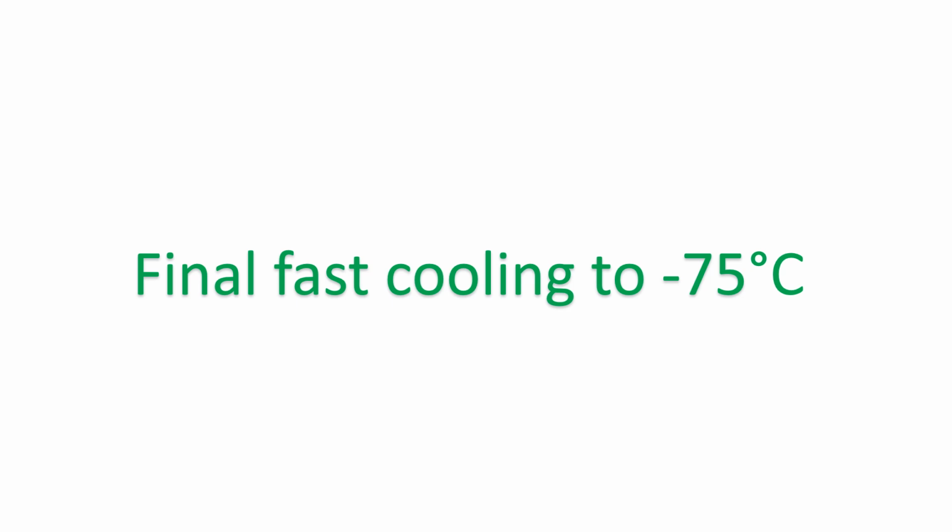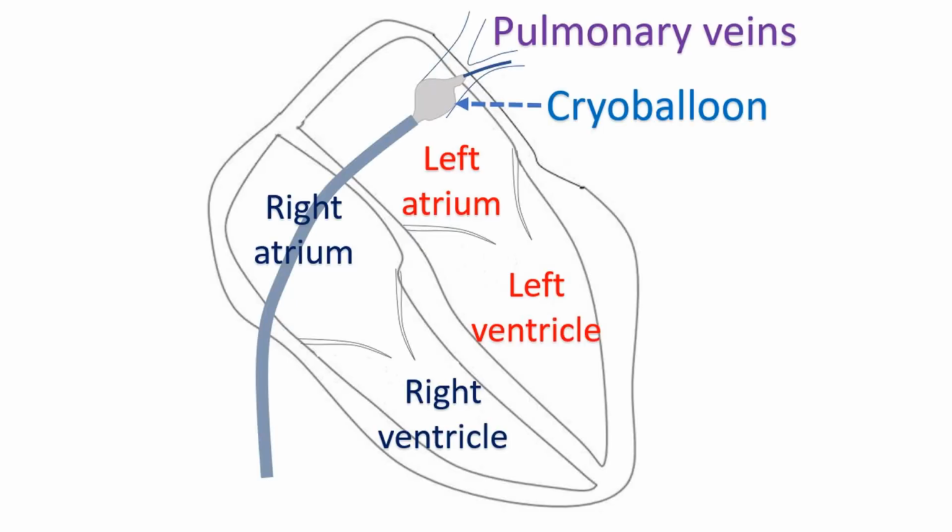It may be noted that, like radiofrequency ablation, cryoablation is also used in other disciplines like cancer therapy. Cryoballoon ablation is a special type of cryoablation in which instead of the usual cryocatheter, a cryoballoon is used for circular cooling. While doing ablation in pulmonary veins for atrial fibrillation, cryoballoon ablation avoids missing of abnormal regions.